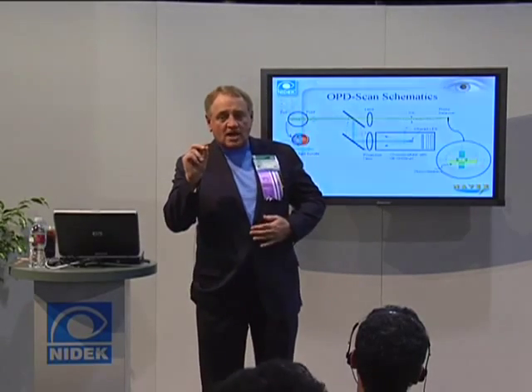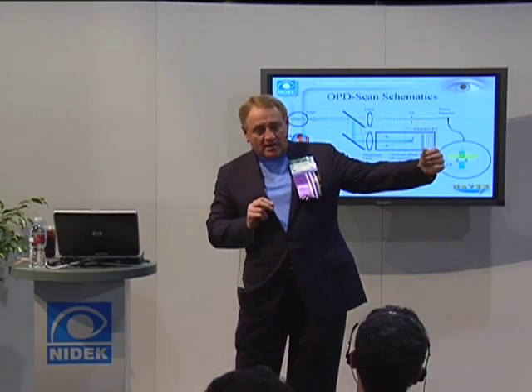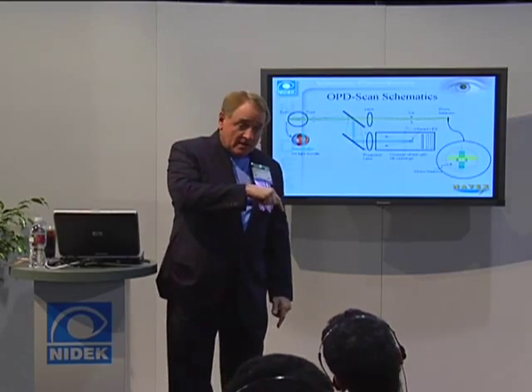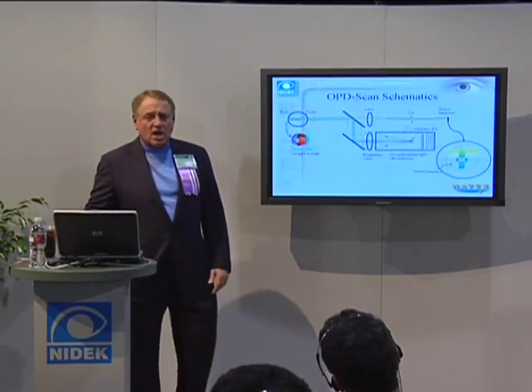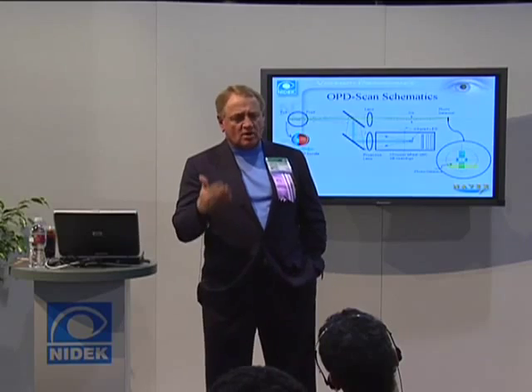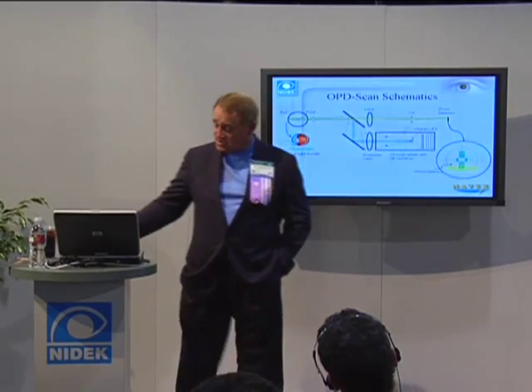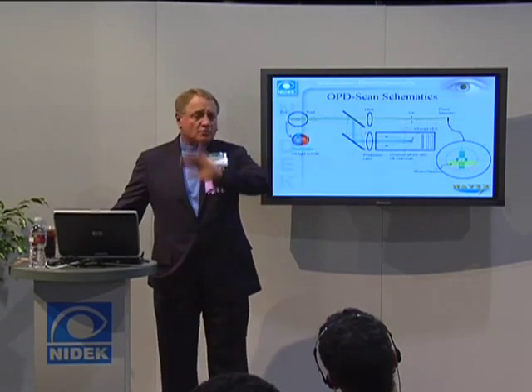So one starts out with the refraction as the primary measurement, the other starts out with a wavefront and has to work backwards to get to the refraction. And it's better to go from the refractive spatial points the other way than it is to try to build it up from the wavefront. That's why it's so much more accurate. None of you can refract your patients from a wavefront measurement on a Hartmann-Shack. You know that. You can't do that today. But from this, you get a refraction that relates to what the patient sees because it's retinoscopy. It's basically automated retinoscopy 360 degrees.